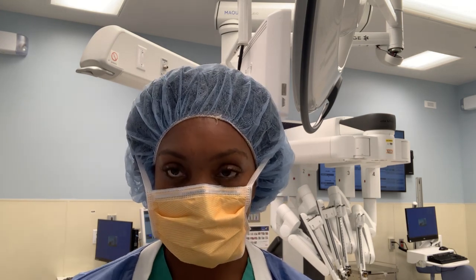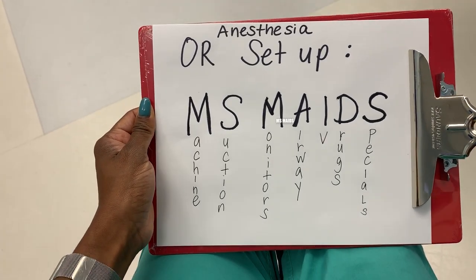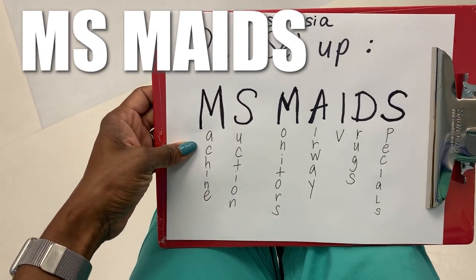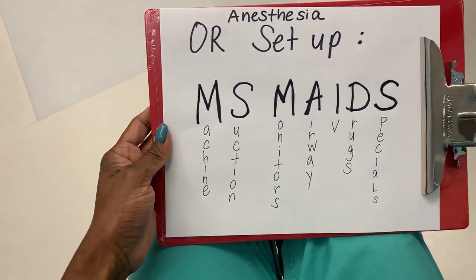So we will go through a mnemonic that we usually use. So this is kind of a nice guideline for your anesthesia OR setup. So the acronym MSMAIDS is what we use a lot of times when we're first starting out to teach how to set up the OR. So the first thing we need to check is the machine. So let's take a look at it.